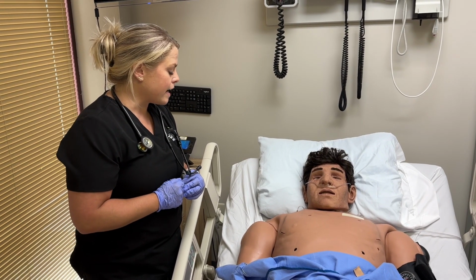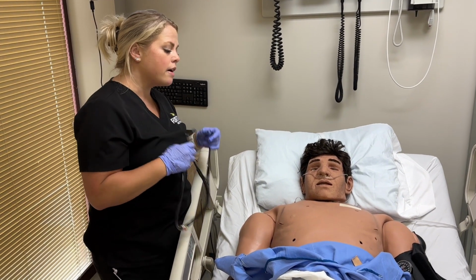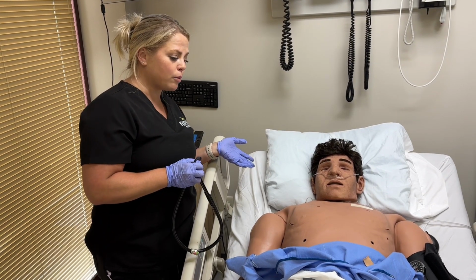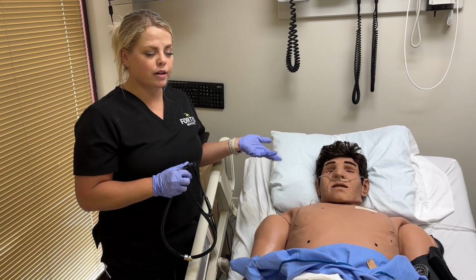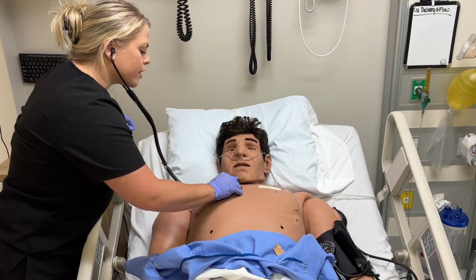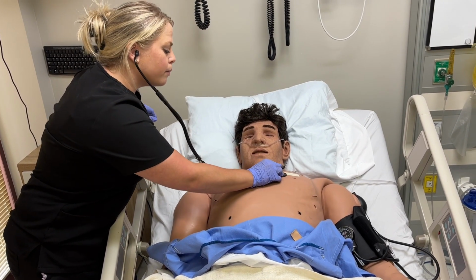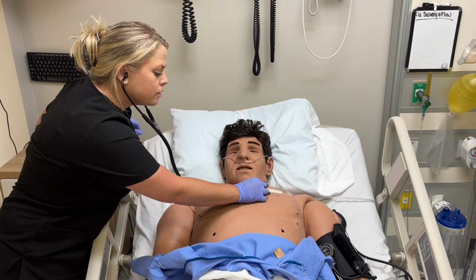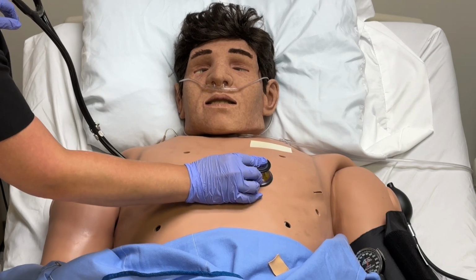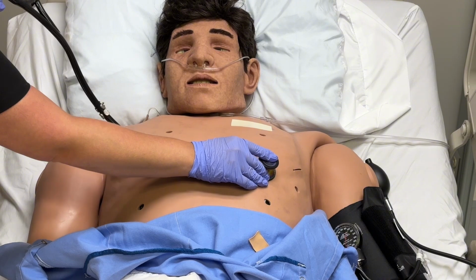Okay. And next I'm going to do his cardiac assessment. So I'm going to listen to all of the heart sounds with the diaphragm and the bell of my stethoscope. And then I would ideally do the apical pulse for a full minute, but I'm going to listen at Erb's point just because it's easier to hear on him. Okay, so I've got my diaphragm, and this is the aortic and pulmonic, Erb's point, tricuspid, and mitral and apex.